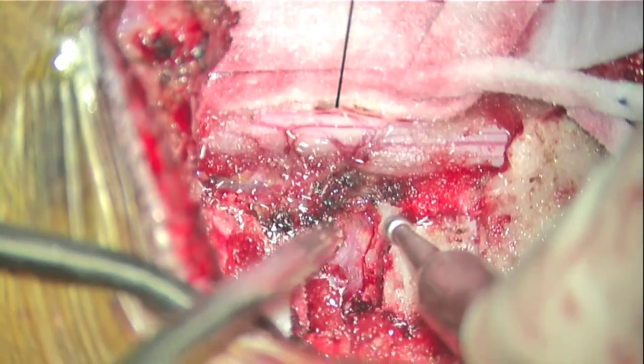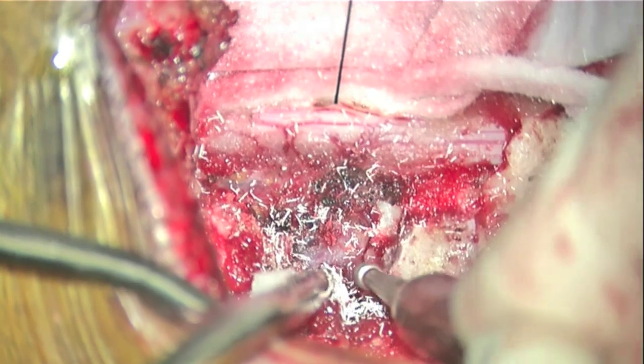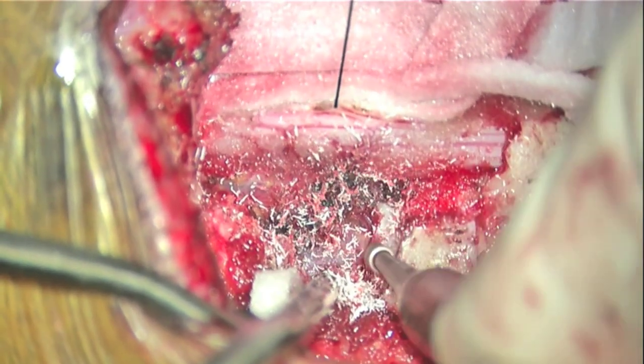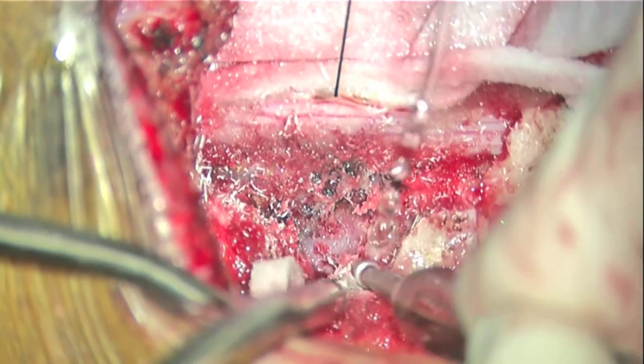This often requires additional bone removal. Here I prefer a small burr. In this case, the C4 pedicle was eroded by the tumor so that the entire C4 inferior facet and pedicle were removed.